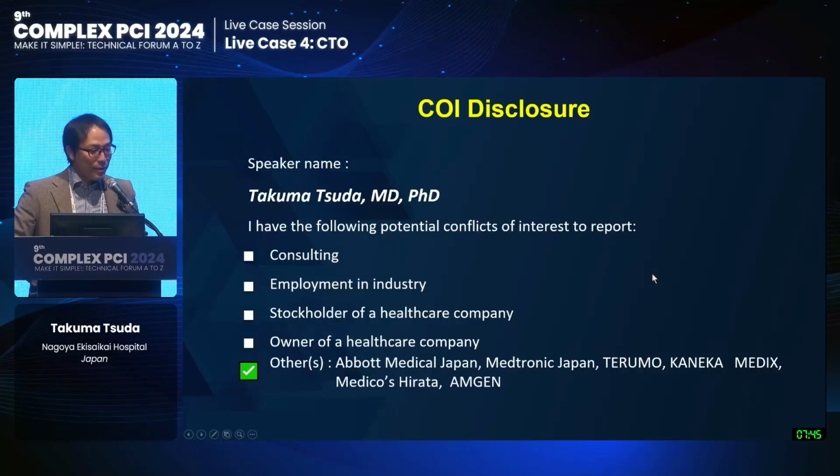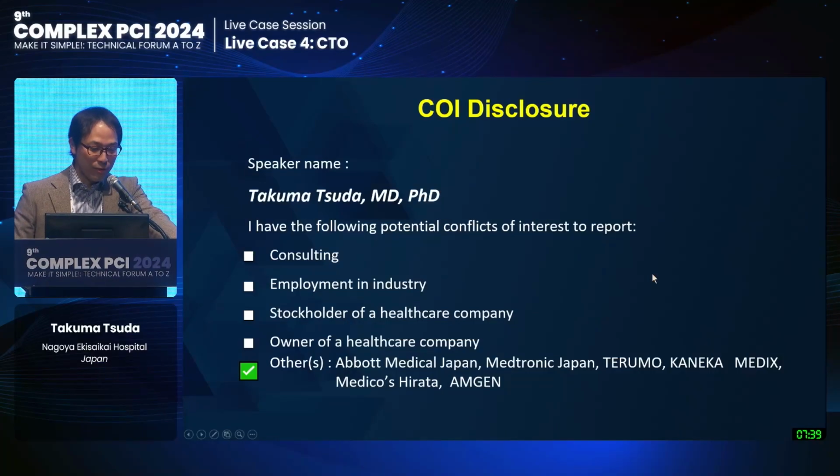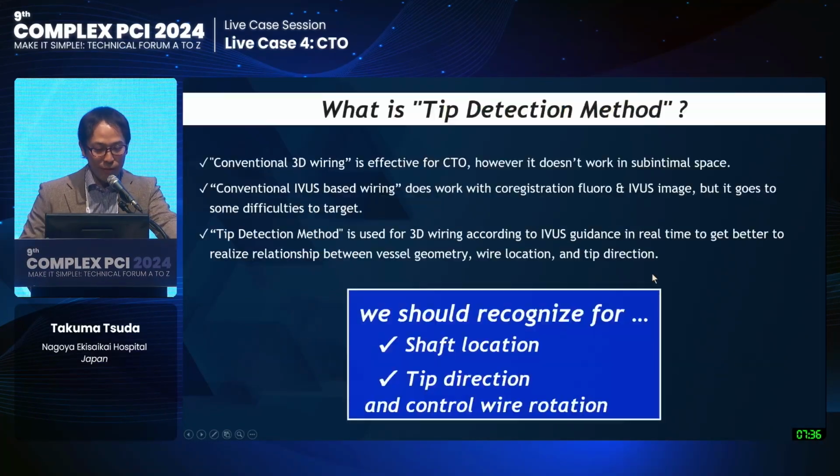Thank you, Chairman. I'm very honored to be here at Complex PCI 2024. So my lecture is about the TD-ADR. But I'm nervous now because Dr. Okamura is really the first opinion leader in this field. So what is the tip detection method?